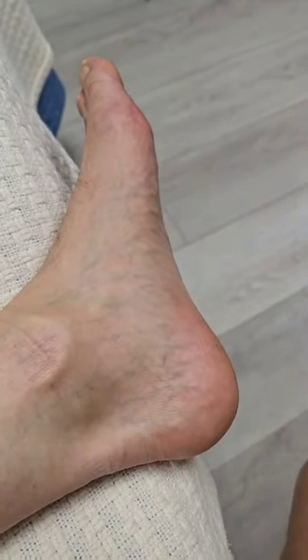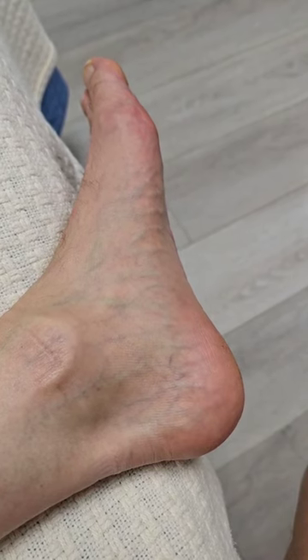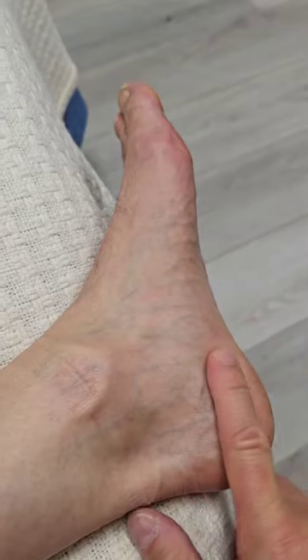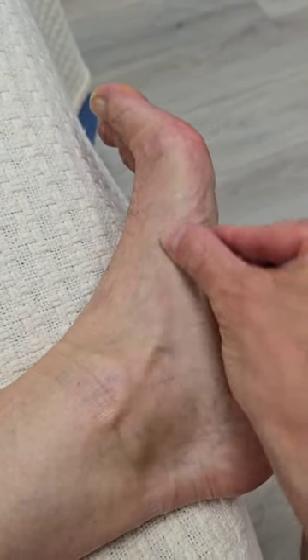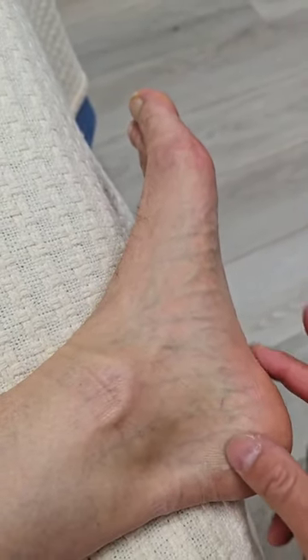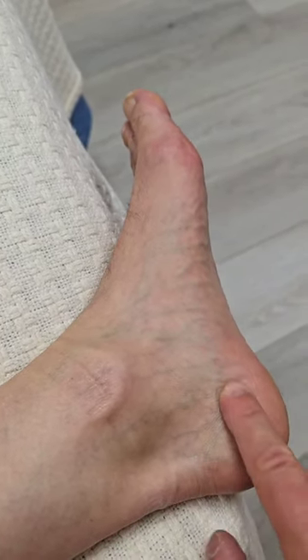So if we want a needle for plantar fasciitis, there might be a couple of things that could be causing plantar fascial pain. Soleus can refer its pain down to here. Gastrocs can as well. Abductor hallucis can, which is here. That can refer it in. And quadratus plantae refers it in as well. So there's just a couple of structures that can do that. So let's just have a look at how we might needle that.